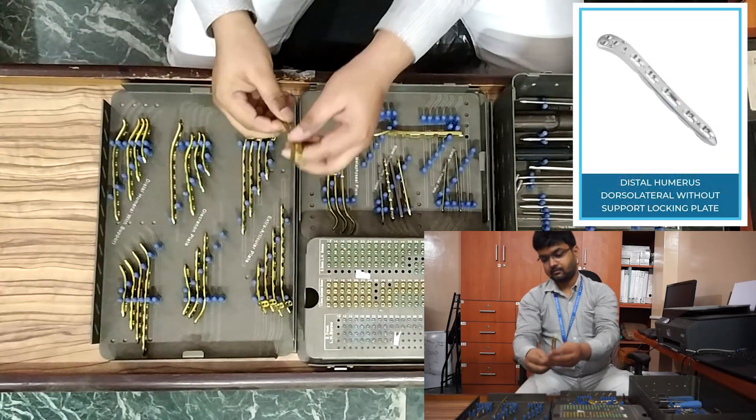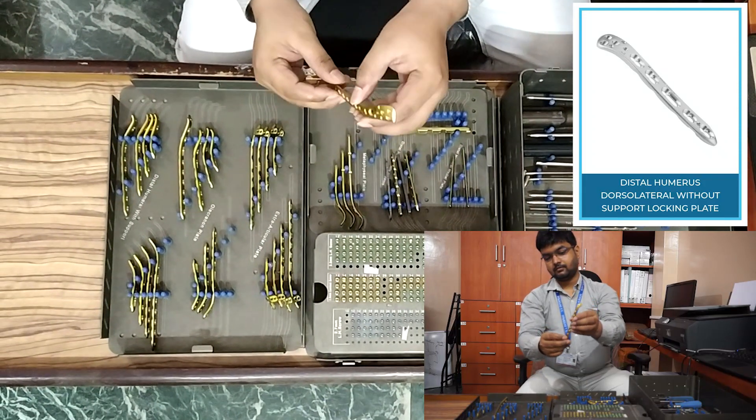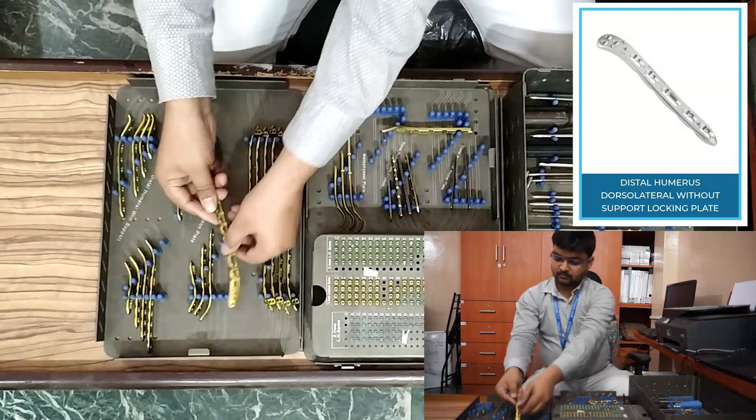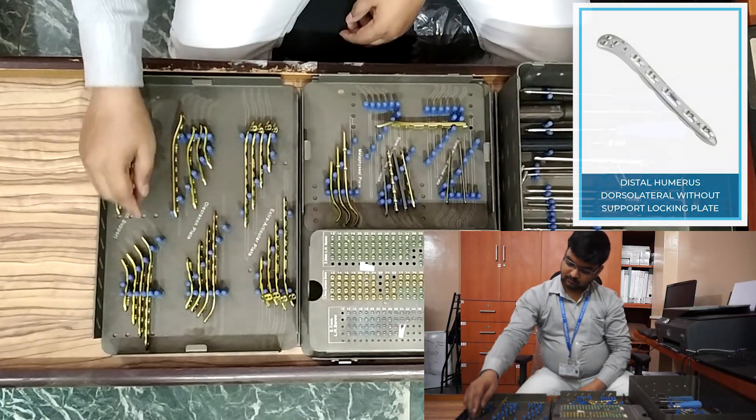Next, distal humerus locking plate dorsolateral without support. This also comes in left side and right side, in three-hole, five-hole, seven-hole, and nine-hole configurations. Longer plates are available.